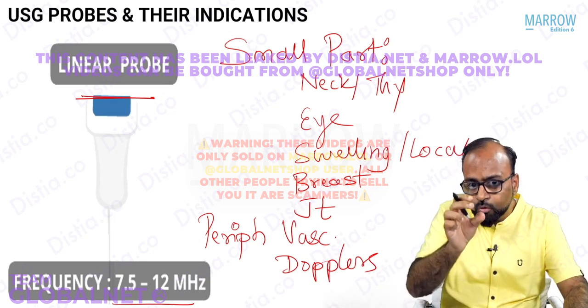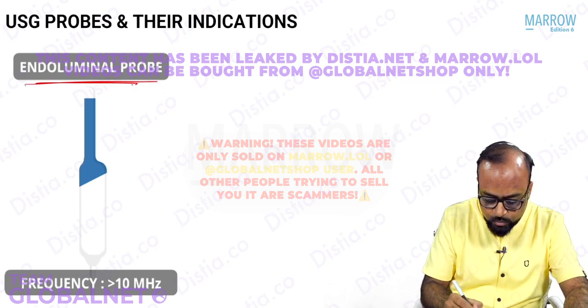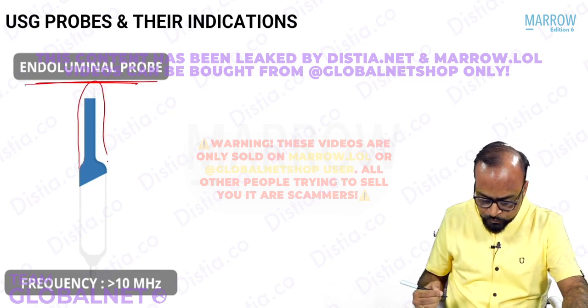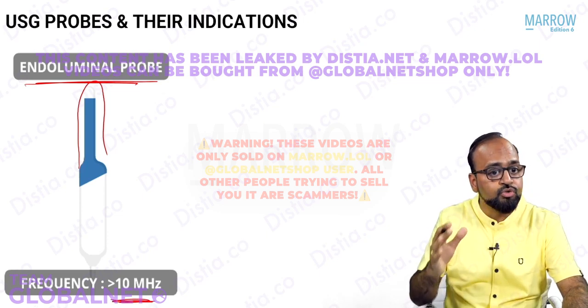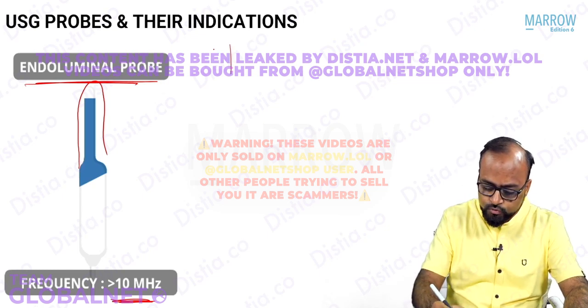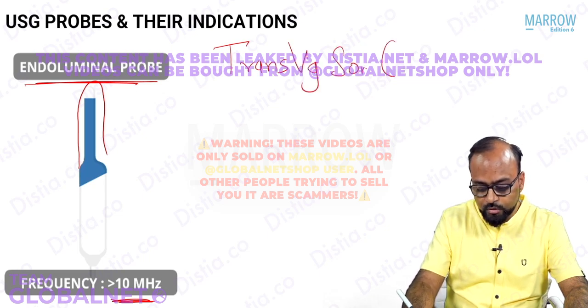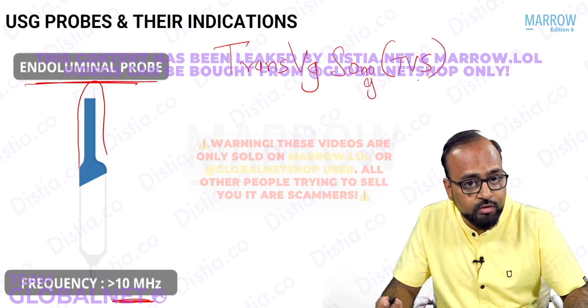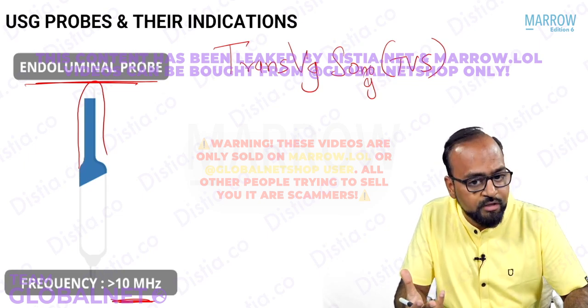Now, a tubular or an elongated probe is called an endoluminal probe. The shape is elongated like this, right? Frequency is high, more than 10 megahertz. And this is the probe which is also called the endoluminal probe, endocavitary probe. So this is used for transvaginal ultrasound or sonography. So this is called TVS, transvaginal sonography, which is done for pelvic organs, early pregnancy evaluation, ectopic pregnancy evaluation.